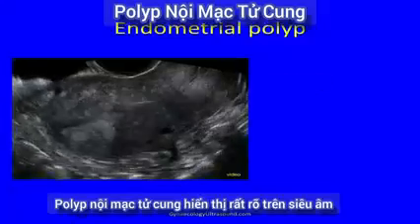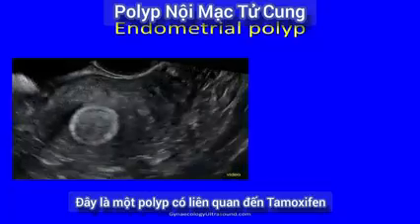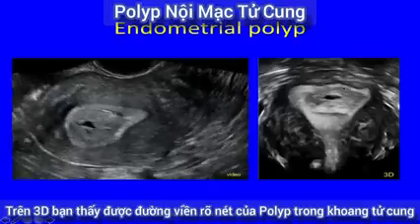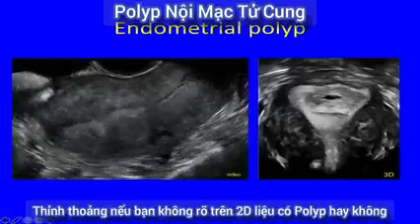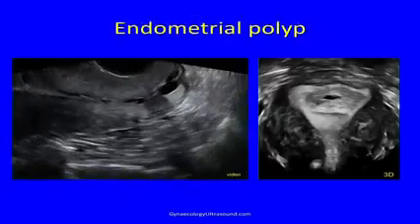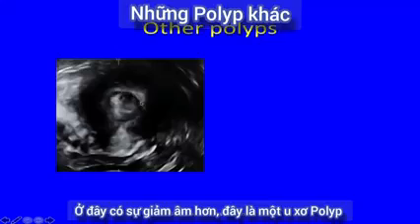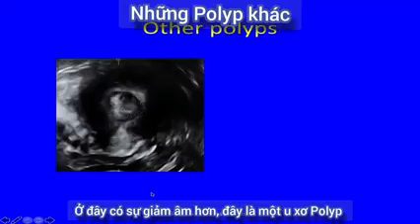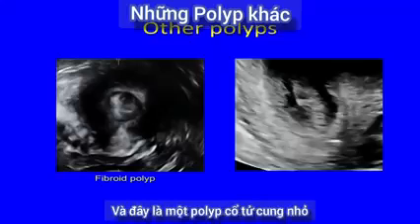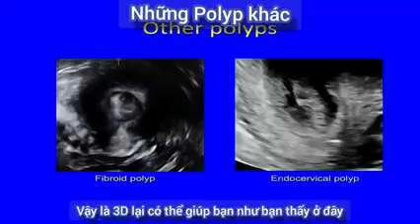Endometrial polyps show up very nicely on ultrasound. This is a tamoxifen-related polyp, and on 3D you can see a really nice outline of the polyp in the cavity. Sometimes when you're not sure on 2D if there's a polyp, 3D can really help you. There are different kinds of polyps — this one is more hypoechoic, this is a fibroid polyp or a submucosal fibroid, and this here is a small cervical polyp. Again, 3D can help you if you look.